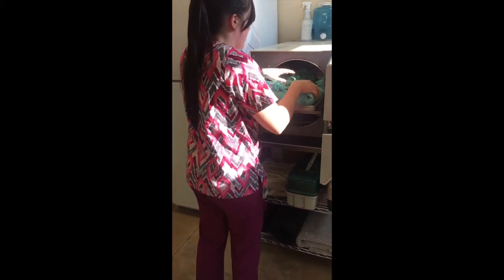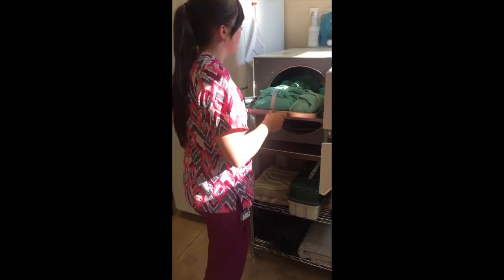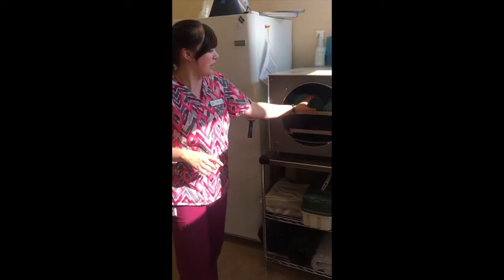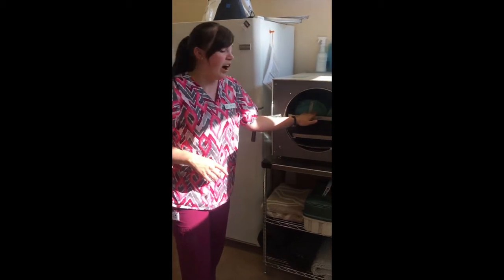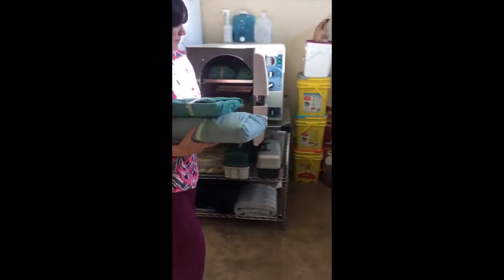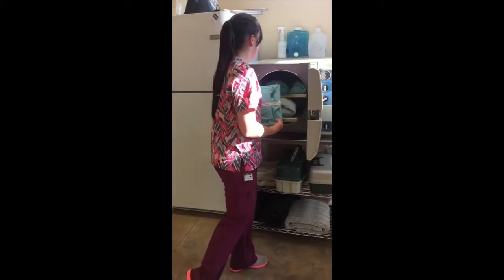Alright. Those are nice and spread apart. So you always want to put your smaller packs, if you have a two-tiered autoclave, on the top, and you want to put your larger packs on the bottom. Now I'm going to pull up my bottom tray, grab my larger packs, and put those in.